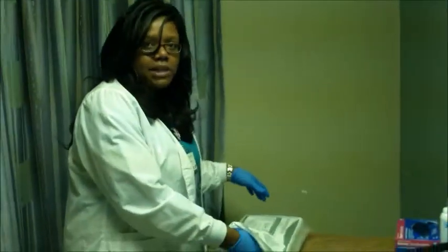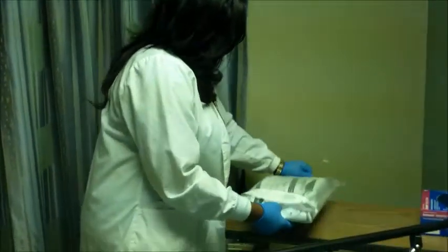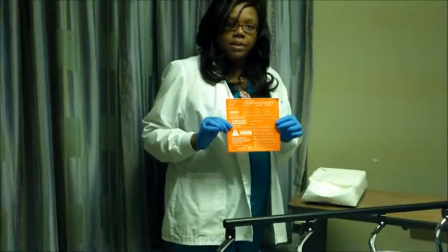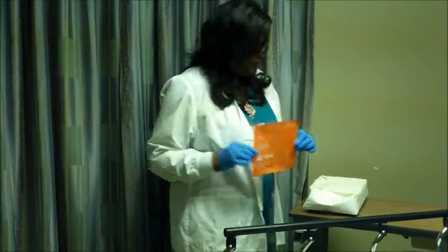During the procedure, you'll see me talking to my patient, just letting them know to feel a little comfortable and talking my way through it. I have a garbage at my side, so I'm going to empty any trash you may see me doing. This is important to keep for later on in the procedure. I'll tell you about proper labeling for the chart as well as the tubing for the Foley catheter.